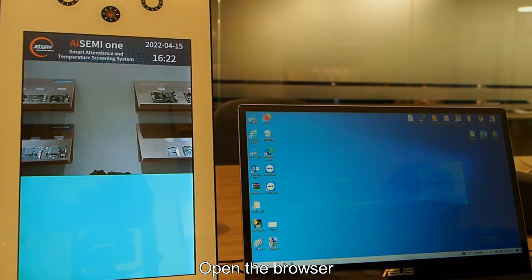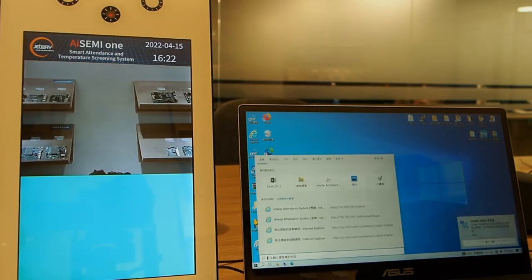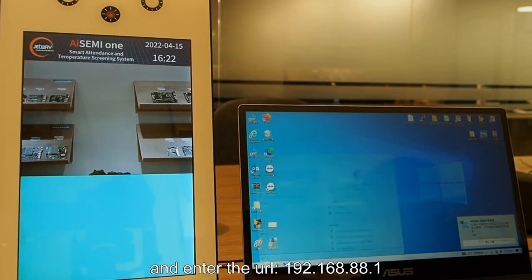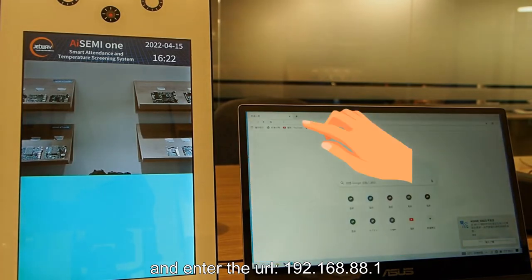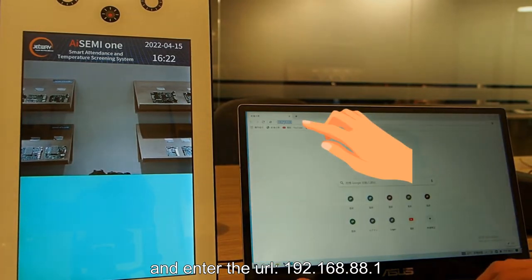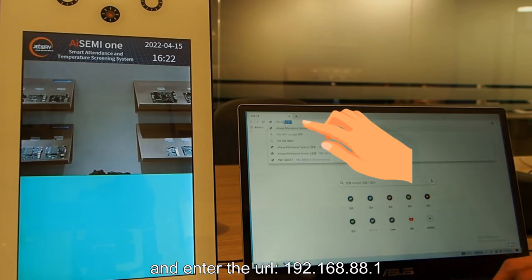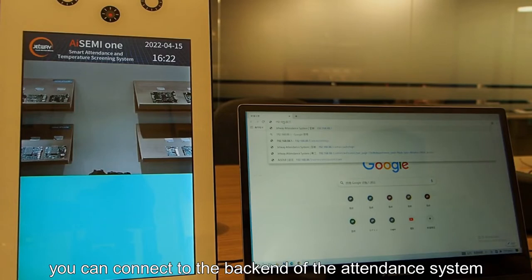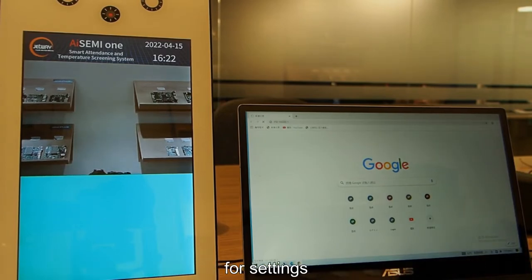Open the browser and enter the URL 192.168.88.1. Connect AiSEMI one box. You can connect to the back end of the attendance system for settings.